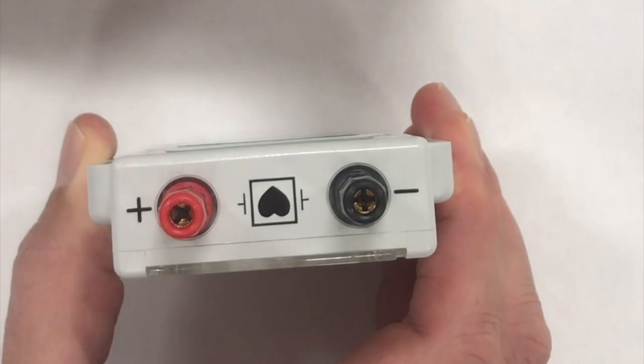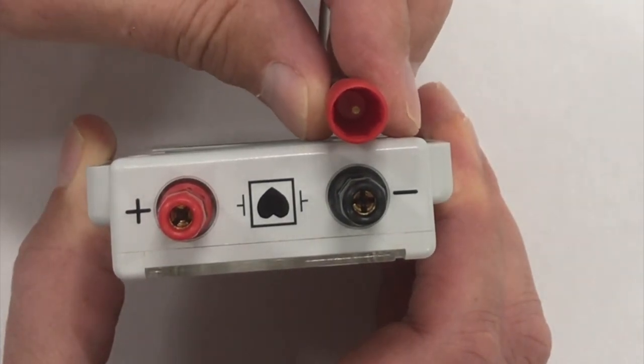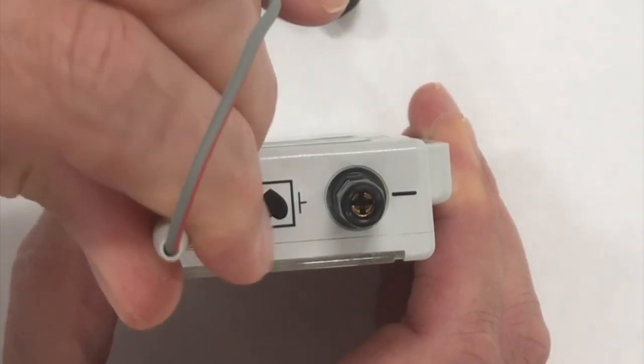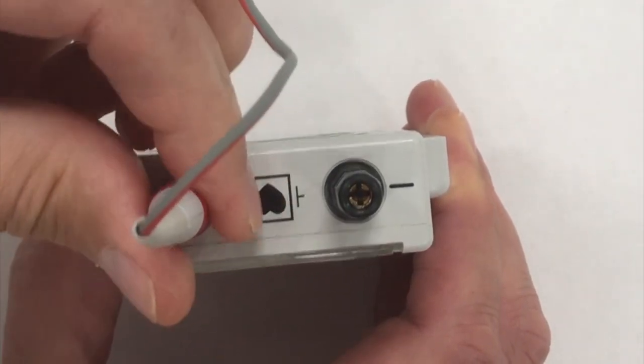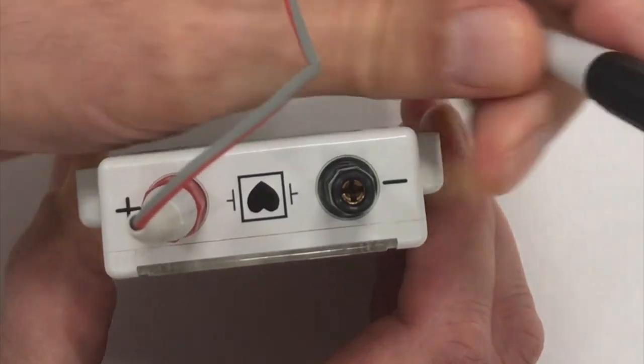So I have a cable here with a pin. You can see the pin inside. And what I'm going to do is just pop that pin into the socket and rotating the barrel tightens the device, tightens the collet onto the pin.